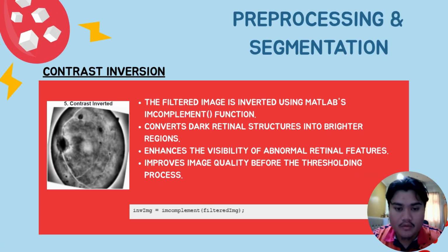I'm Wafi bin Yusli, and next I'm going to present the next process, which is contrast inversion. Contrast inversion inverts the filtered image using MATLAB's imcomplement function to change the dark retinal structures to brighter regions and make the abnormal retinal features easier to detect.